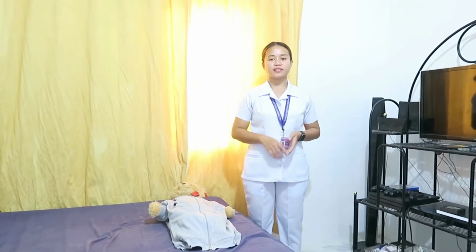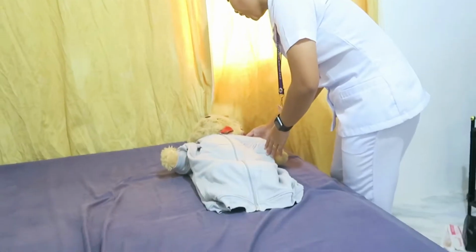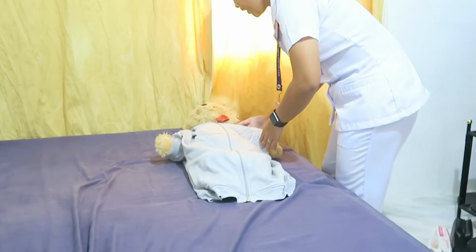The first thing to do is to shout for help, but before doing that, you must make sure that the environment is safe for both the patient and the health provider. So let's see if the area is safe. So the scene is safe. Are you okay? Ma'am, help!